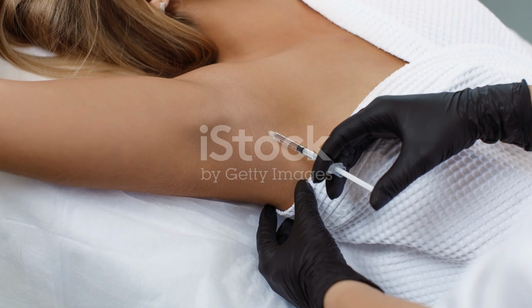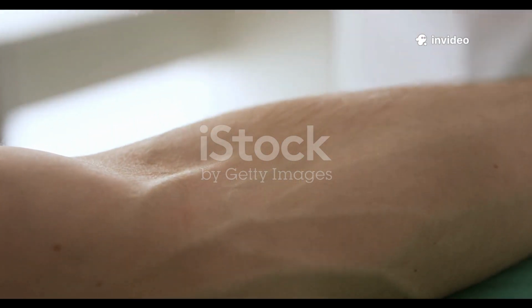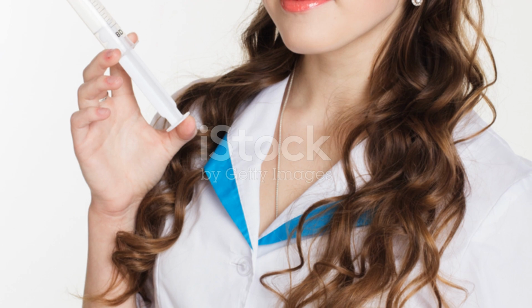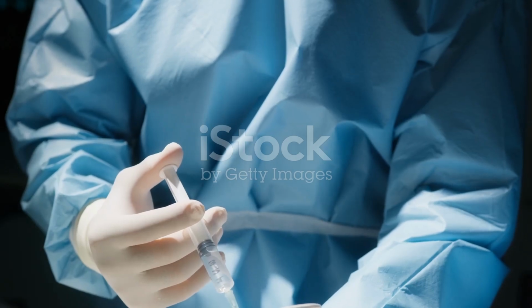Position the patient comfortably. Clean the injection site with alcohol swab using circular motion. Hold the skin and insert the needle at 90-degree angle. Aspirate if required by protocol. Inject medication slowly and steadily.